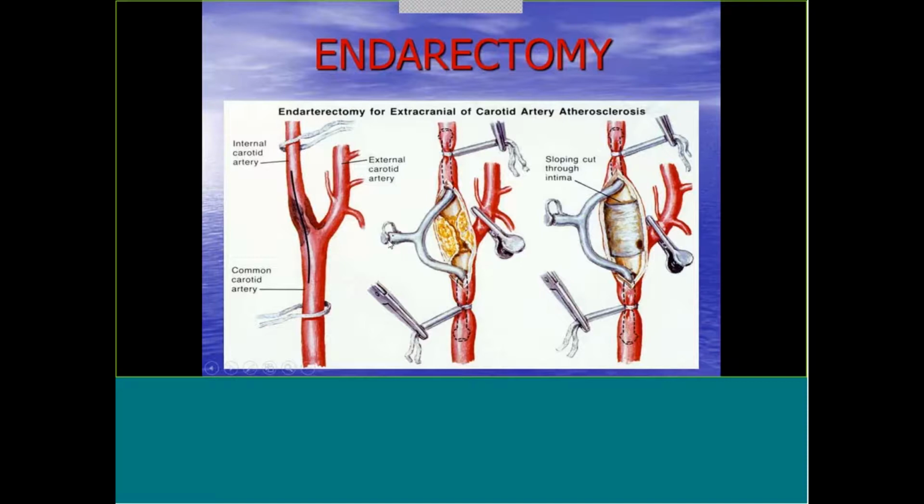But you can see where the ligations here don't literally clamp the vessel like this, because these are plastic, so they're very, very soft. They don't want to completely impede flow, so they use the ligators to secure these without impeding the flow.